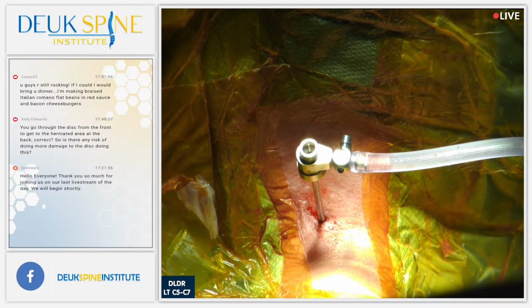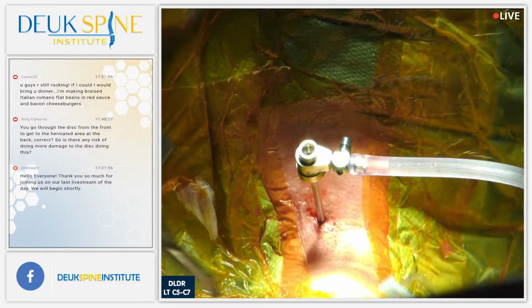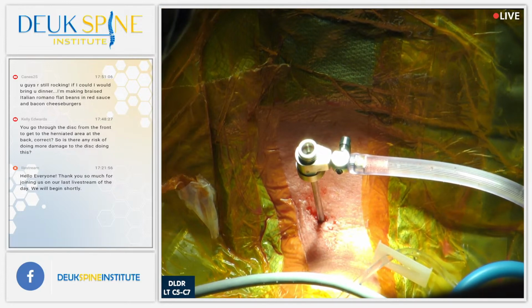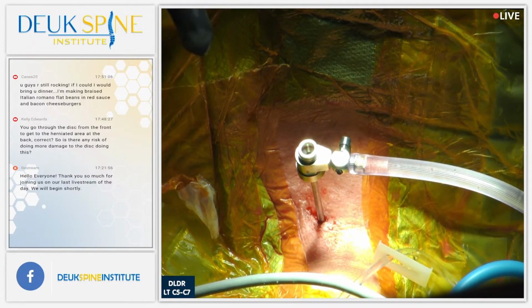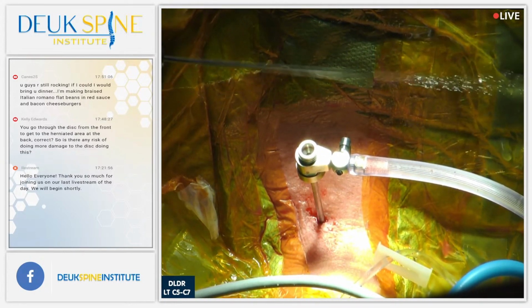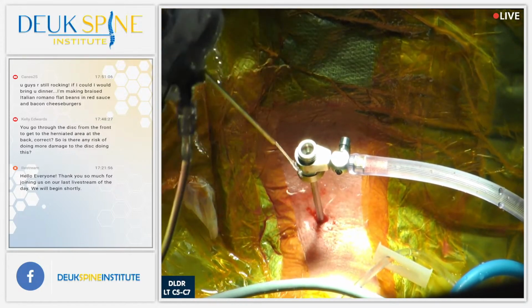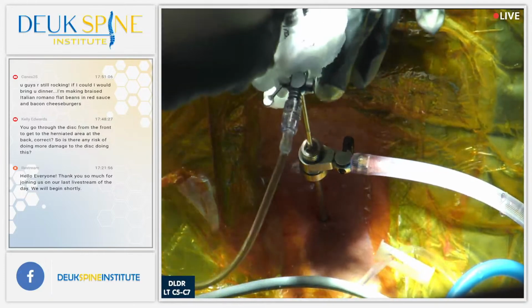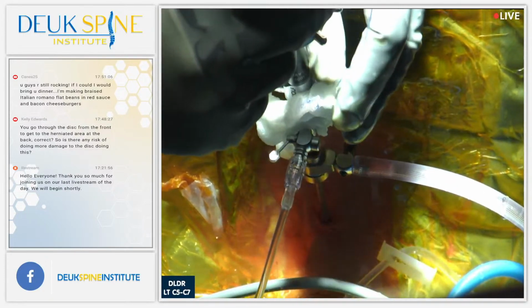We have a question. This comes from Kelly on YouTube. All right, Kelly. Happy to take your question. They said you go through the disc from the front to get to the herniated area at the back, correct? Yes. Is there any risk of doing more damage to the disc doing this?